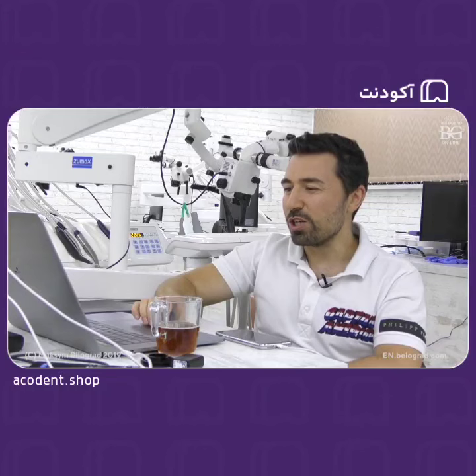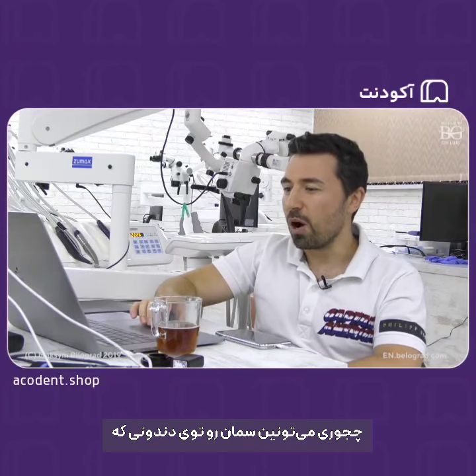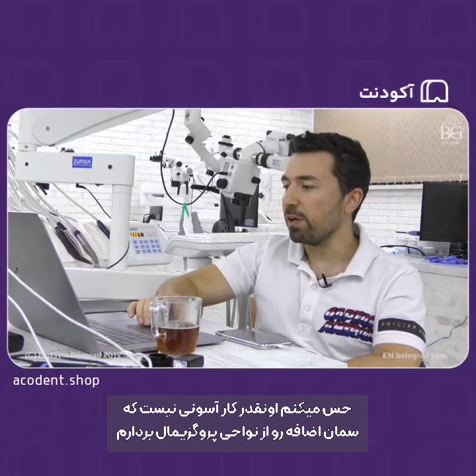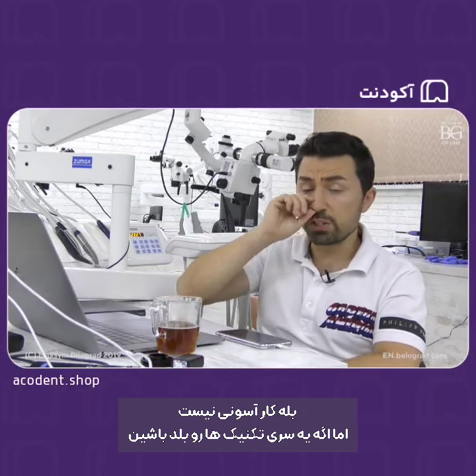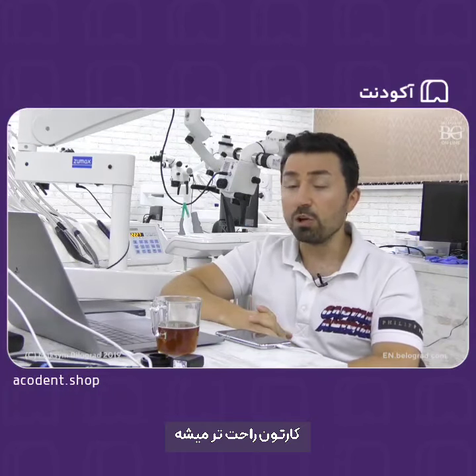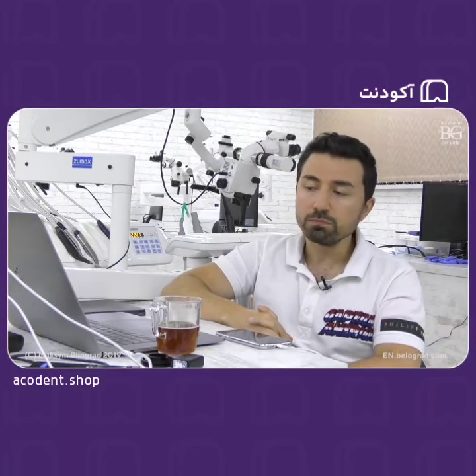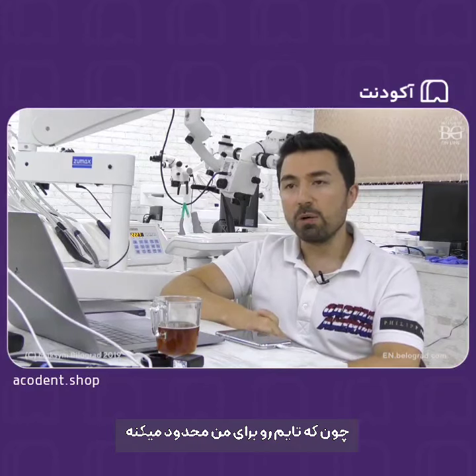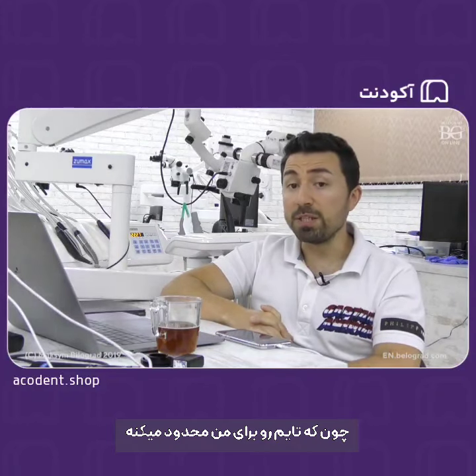Okay, another question from Poon. How can you manage cementing the veneer lay on a tooth that still has proximal contact with adjacent teeth? I feel it's not that easy when I try to clean excess cement on the proximal areas. Yeah, actually, this is not that easy to cement, but if you know some tips and tricks, your life will be easier. So, first of all, as I mentioned before, I don't like to work with dual cure cements. One of the reasons is I'm limited in time.